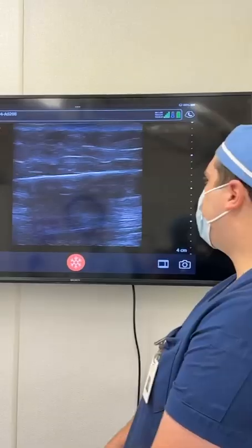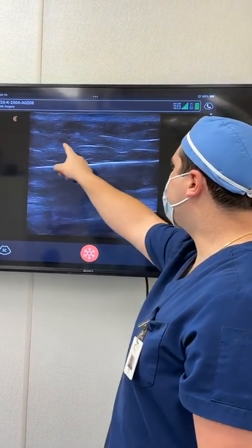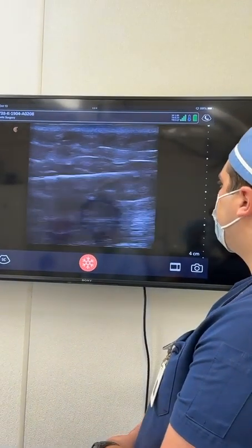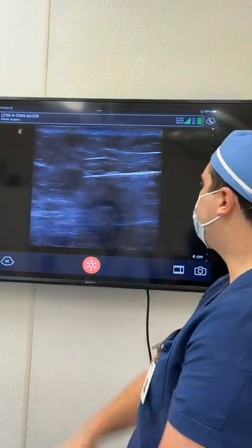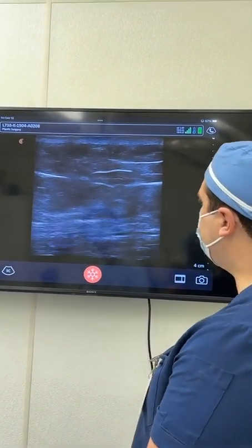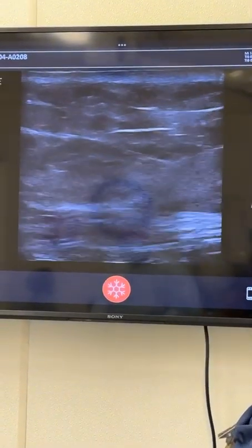Alright, so this is Dr. Patino's cannula right here. This is the deep gluteal fascia. This is the striated muscle. This is the superficial gluteal fascia, and that's the patient's skin. And I'm gonna wiggle the cannula again. Can you see it wiggling there? And I'm gonna withdraw it. Can you see the tip? I'm gonna go ahead and give it the cloud of fat. You see the fat going in? So we see fat entering the space, and you can see the deep gluteal fascia is getting pushed down as fat enters the space.